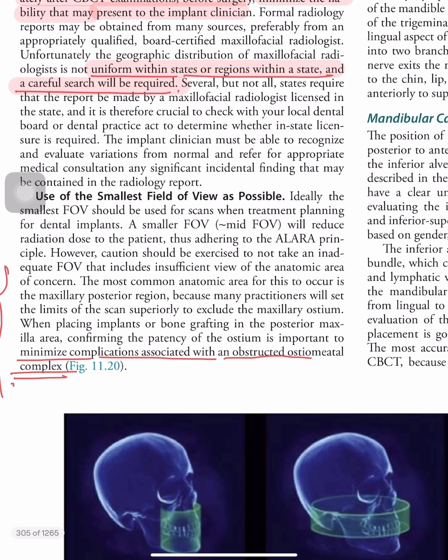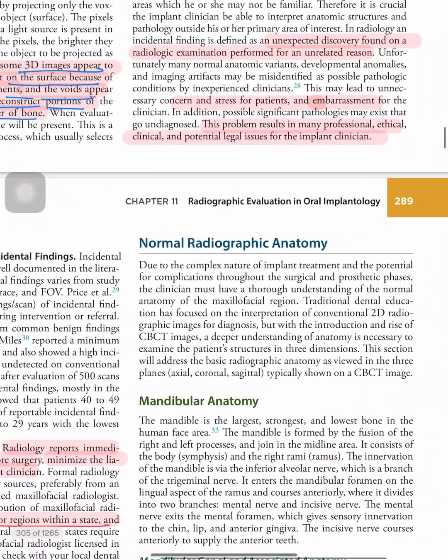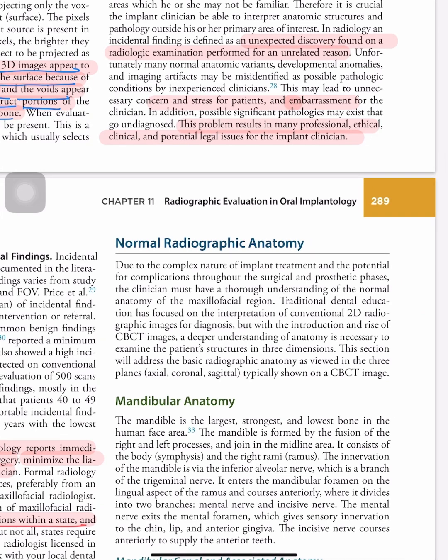Now again, how to mitigate it? Use the smallest field of view possible. But again, I will not recommend this. Whatever field of view is needed, you definitely ask for it. Normal radiographic anatomy. This part will be taken by Dr. Akriti.